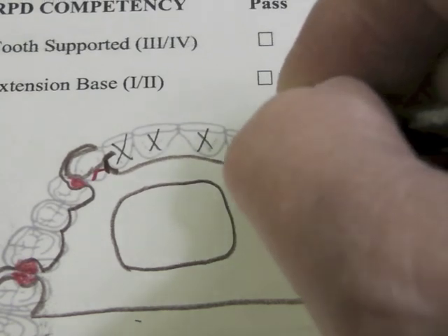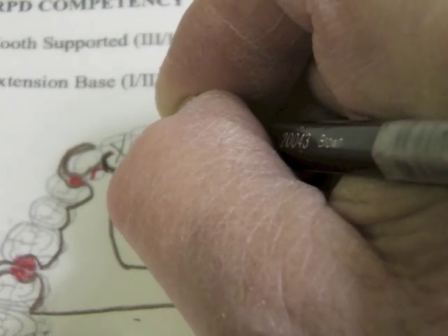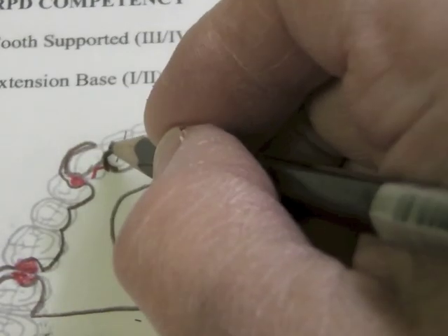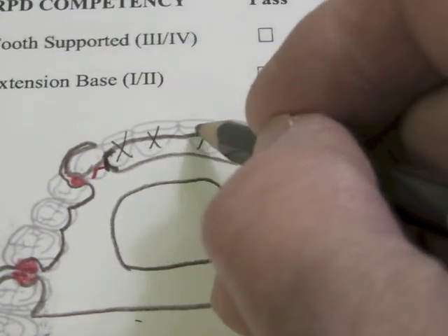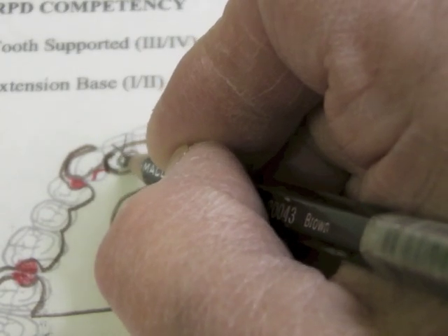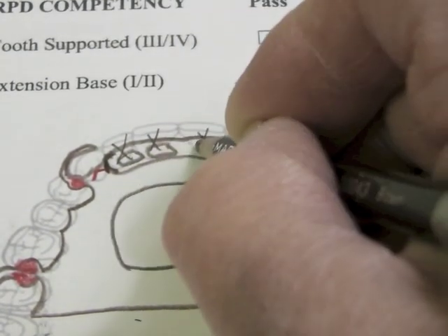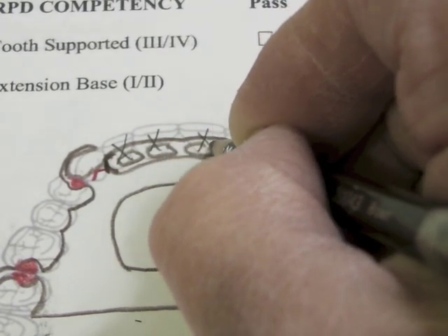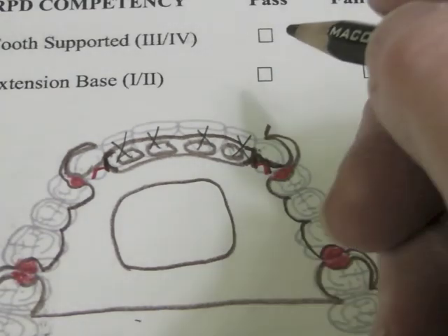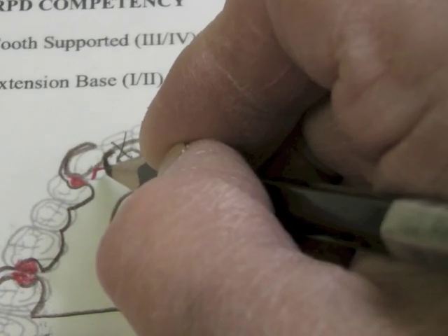And then at this guide plate we're going to come back across basically just the crest of the ridge or slightly buccal to it with another finish line here and then included in this area we'll have some loops that are opened up where acrylic can flow through that and lock these teeth, the denture teeth, onto this framework.